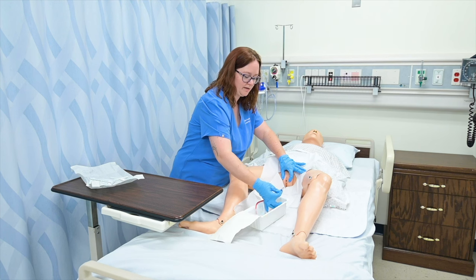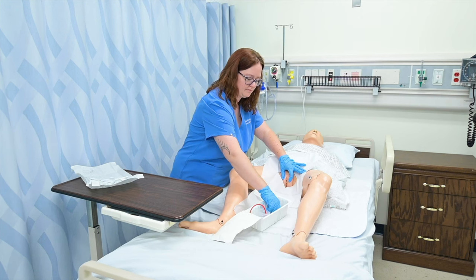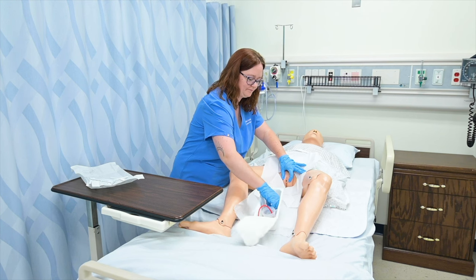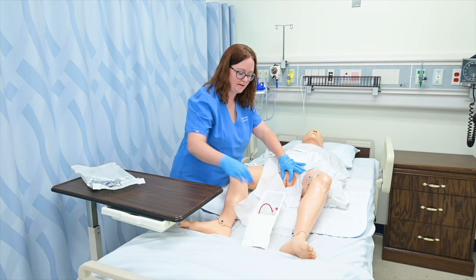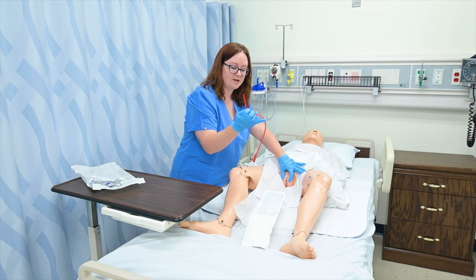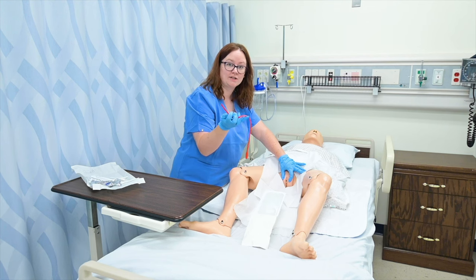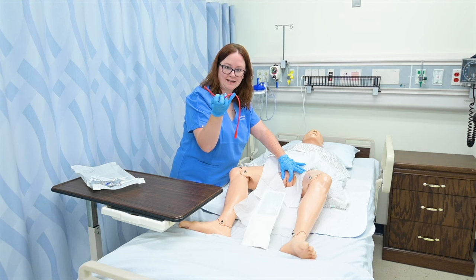I'm going to go ahead and remove my bag of lubricant. Oh my goodness, there we go. All right, and now I'll go ahead and grab my catheter. Now, this of course is an open catheter, meaning there's no bag on the end. Once this gets inserted into their urethra and accesses urine, urine starts coming out the end of this.